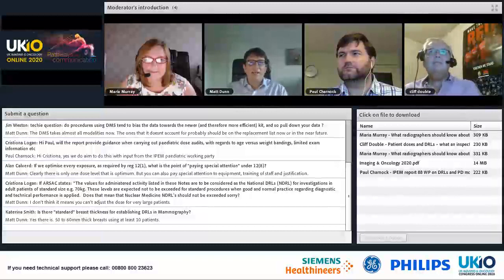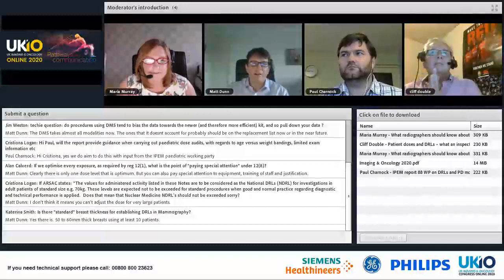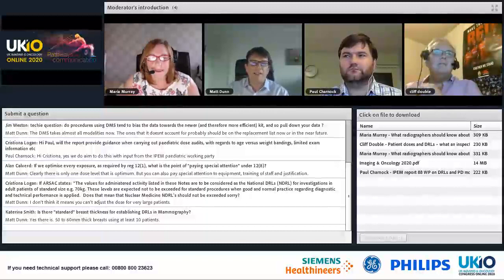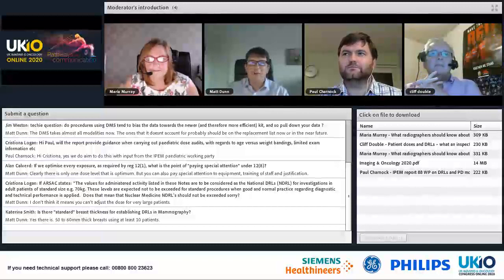I mean, the 75th percentile was probably chosen to say, well, the worst quartile probably need to think about their doses and optimize. So they might have old equipment or they might have poorly optimized practice. It's interesting when you get to a situation where most of the systems are optimized, then the third quartile isn't a good measure anymore, because it's a bit like the frog crossing the road, where you cross halfway across the remaining portion of the road and you never get there. So if we keep using the third quartile, then eventually the doses would be zero, and that's clearly not possible.